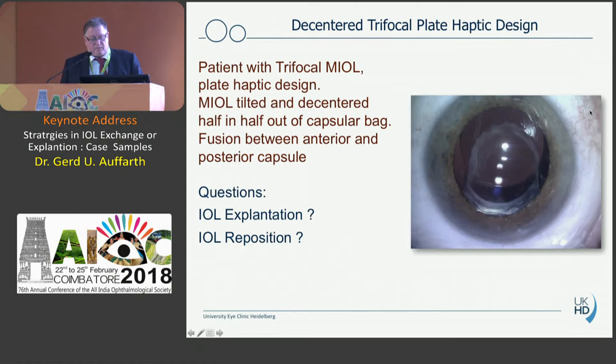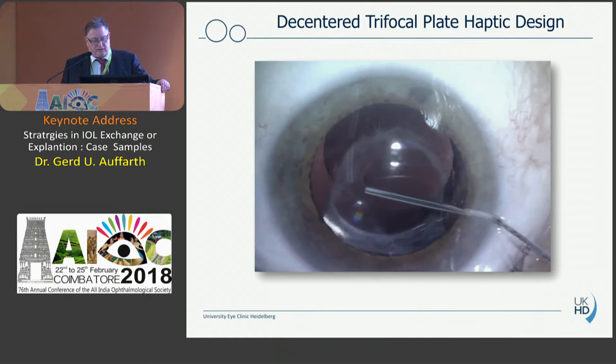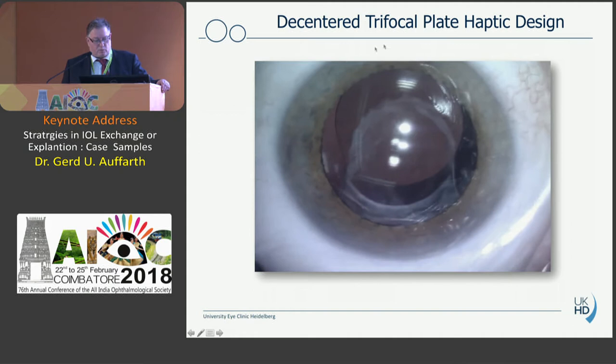Sometimes you have a situation where you cannot really see what's going on. Here we have a trifocal IOL which is obviously decentered — part of the lens is inside the capsular bag, part is outside — and the patient suffers from a lot of problems because of the decentration and fibrosis of the capsule. Sometimes you only see during surgery whether you have to take the lens out or can repair it. So first put some cohesive viscoelastic like Helon or Helon GV. You can see that the haptic is out and the rest of the lens is somewhat in — a very strange situation.